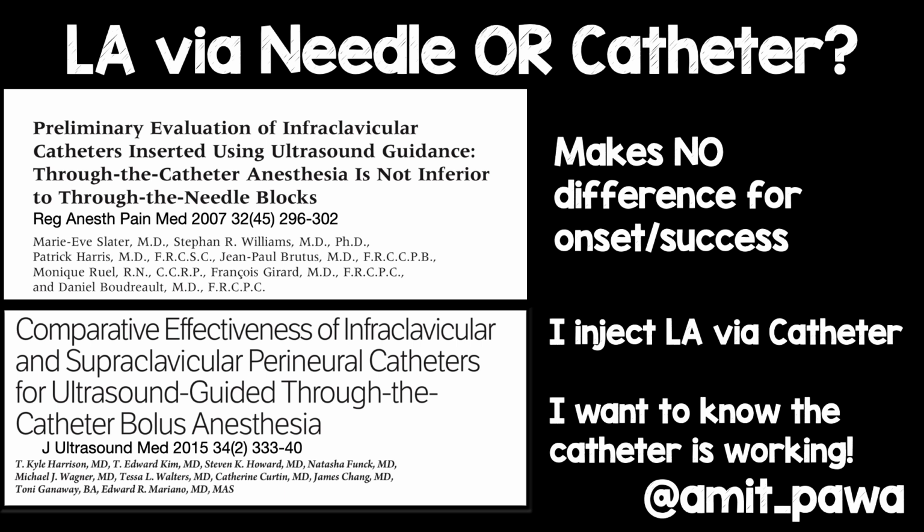I know some people do a hybrid. I know Keijin Chin injects some local anesthetic via the needle, then threads the catheter and injects the rest via the catheter. But for me, certainly when I haven't got a massive catheter practice, I want to make sure I know the catheter is working. And the only way I can know that for sure is by injecting local anesthetic via the catheter.